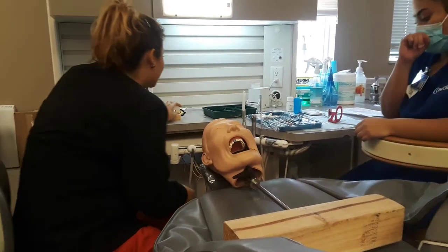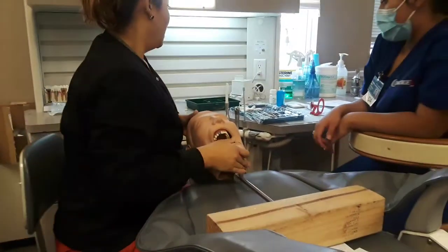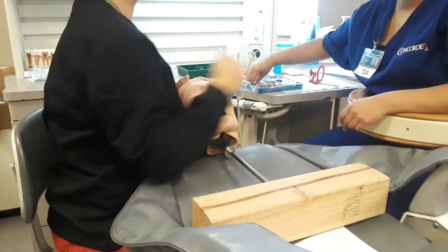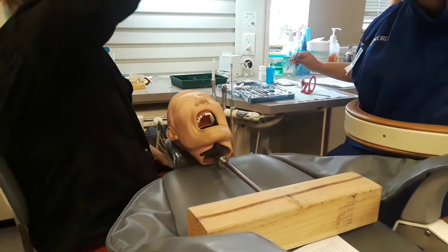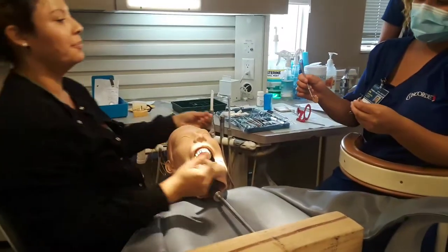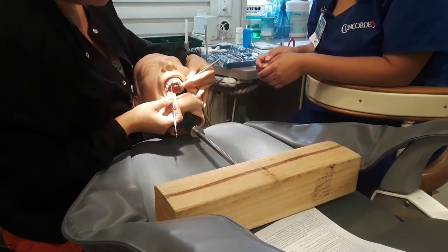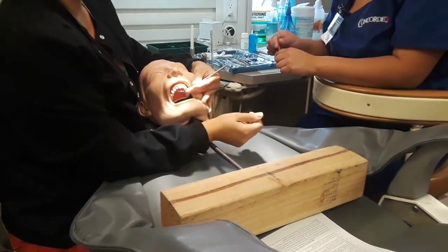I've got some crowns here. I don't think there's an anterior tooth, but you guys will get the gist. Here's your procedure. Someone guide us. We're just going to show you tooth number eight and nine — basic pass. Hey patient, do you want to get numb today? He's going to say no, so we can skip that. The majority of your patients are going to say no.